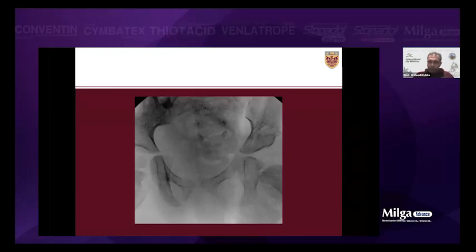Once I feel things are tight now, I'm very careful with the stability test after capsulorrhaphy because I don't want to weaken or loosen the knots I did. But once you do every step carefully, you're fine. Unless it's very unstable.